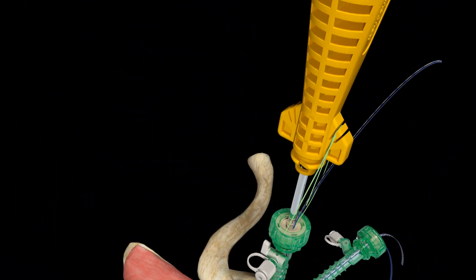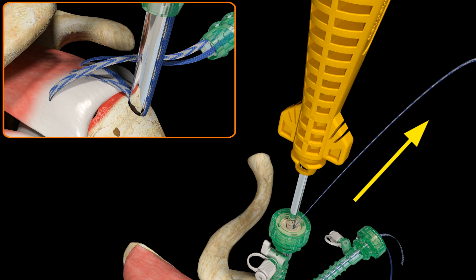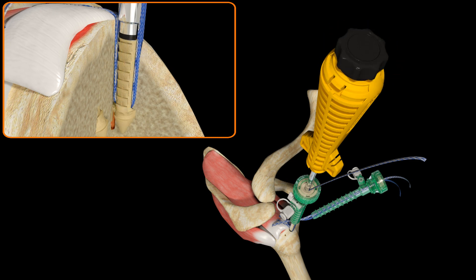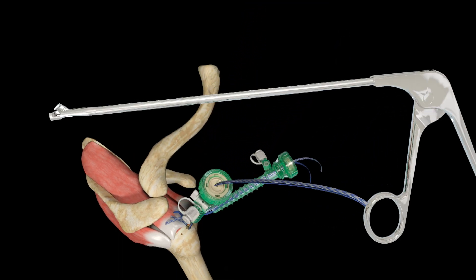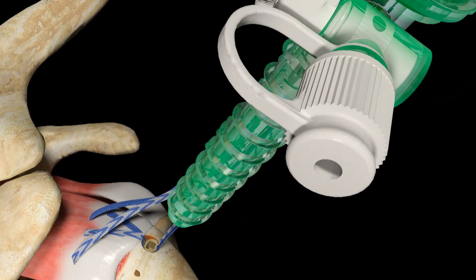Release the green stay suture from the inserter cleats, slide it out of the Footprint Ultra PK anchor, and discard. Maintain light downward pressure on the anchor inserter while individually tensioning the limbs of Ultra Tape through the anchor until the desired repair tension is achieved. Keeping light downward pressure on the inserter, rotate the inserter knob clockwise to deploy the interlocking screw until a loud click is heard, then rotate one quarter turn counterclockwise to allow easier separation. Remove the inserter and cut the excess limbs of Ultra Tape flush to the anchor using the Smith & Nephew suture cutter.